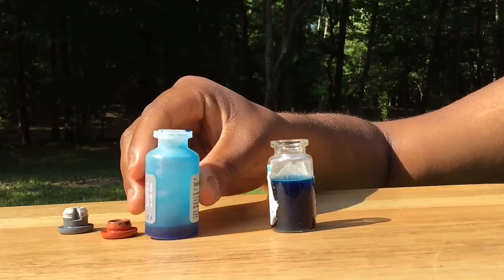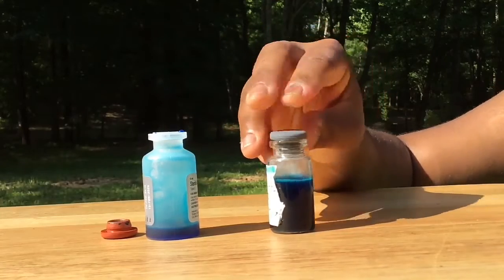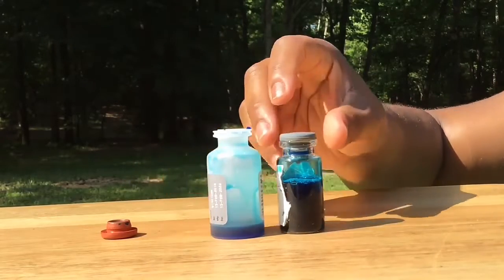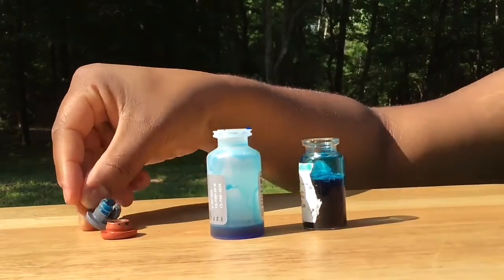Put the lid back onto the vaccine bottle and shake the vaccine bottle for the length of time listed in the instructions provided with your particular vaccine. Then, take the lid off the vaccine bottle and pour the contents back into the diluent bottle.